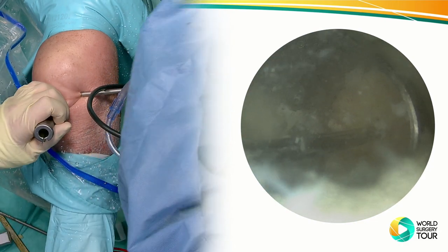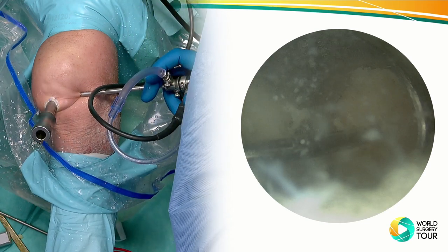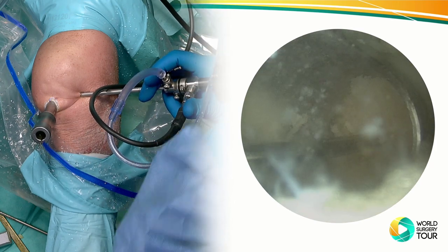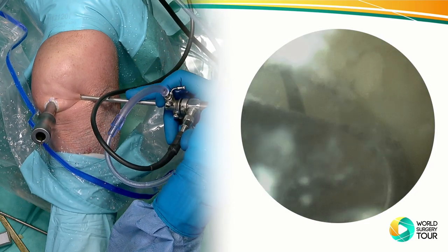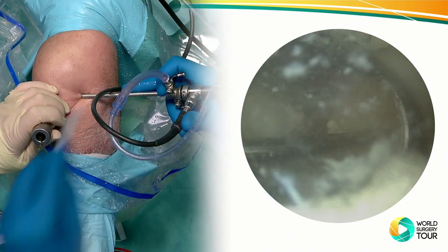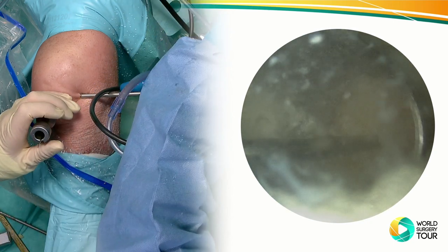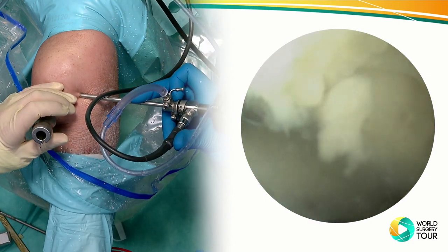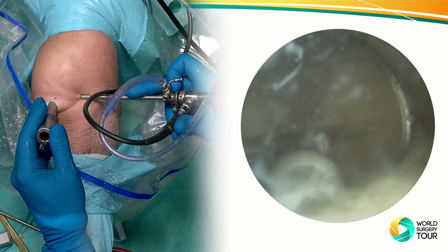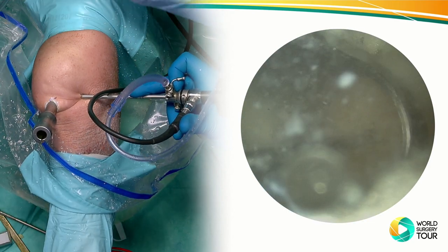Can you cut me the cannula where the spinal needle is? Just take the spinal, exactly, cut the top off. Can you just change it in a maybe orthogonal way? I'll try to suck it out. It's too short, it's going to fall in there. Okay, wait a second, we need a different shaver blade. Yeah, the shaver blade is clogged. He's changing the shaver blade.